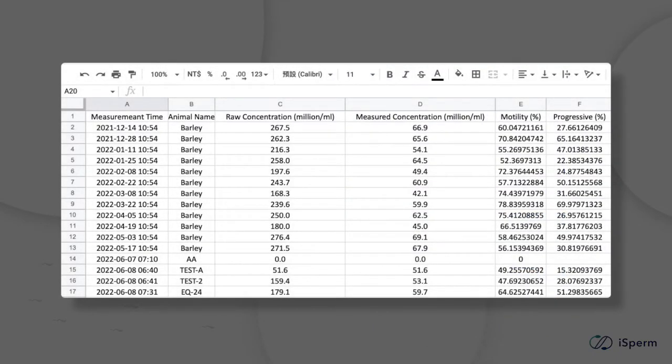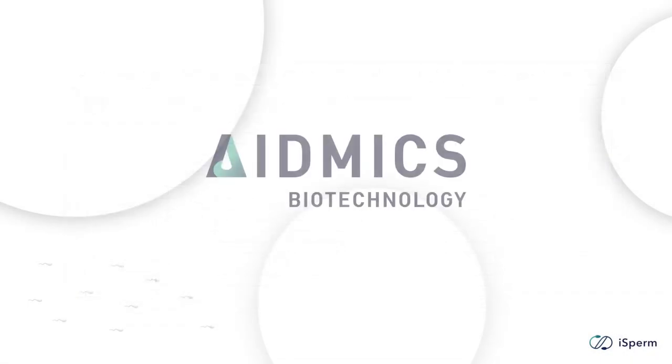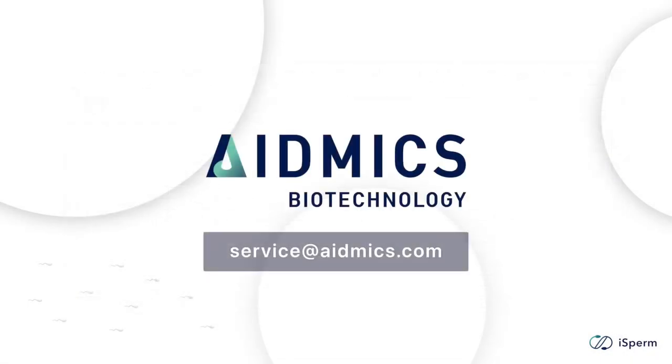This is generally how the system works. If you have any questions, please feel free to contact us at service@aidmix.com.